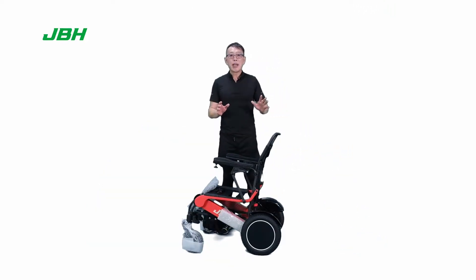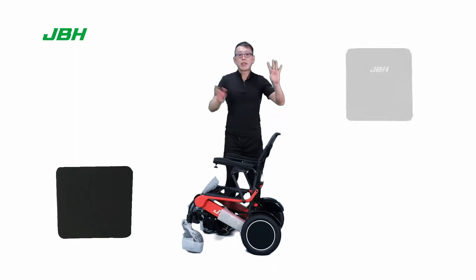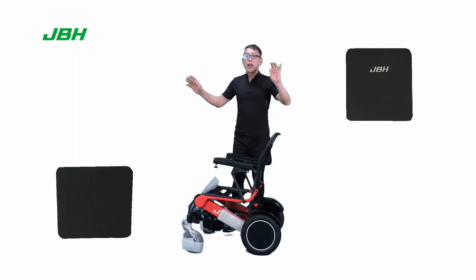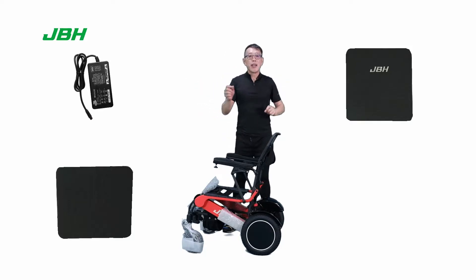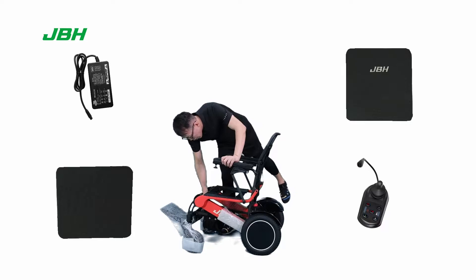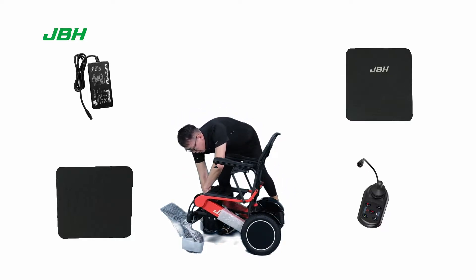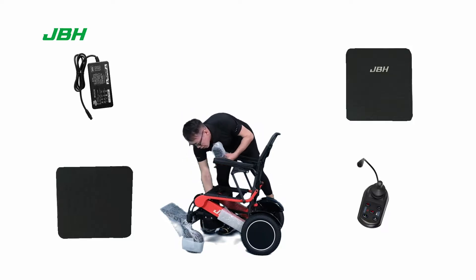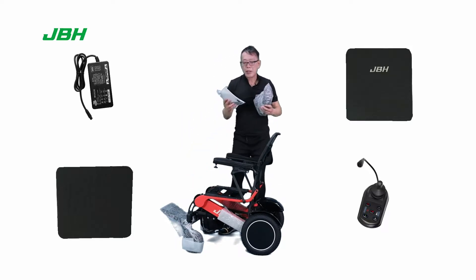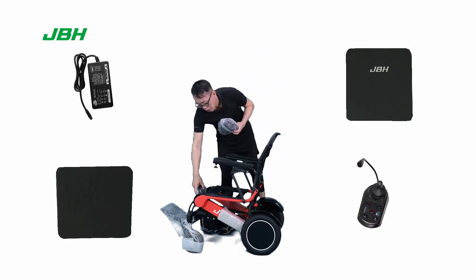Please check that you have a seat cushion, a seat back cushion, a charger, a controller, and a pack of user's manual and simple tools with a safety belt inside the storage bag here.